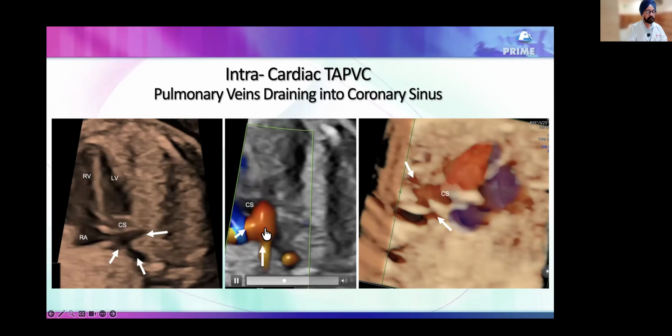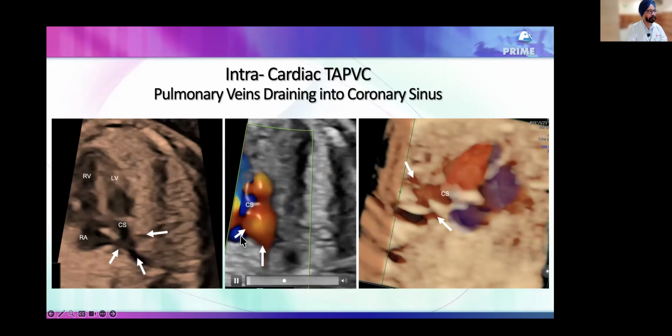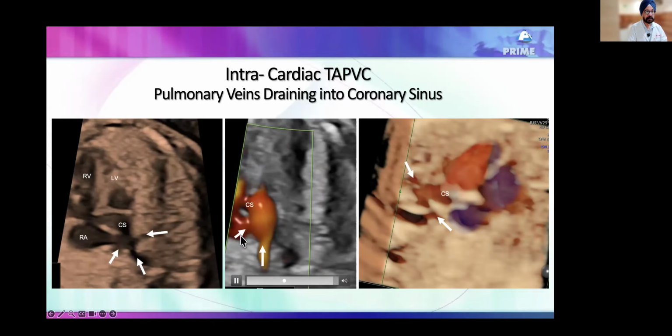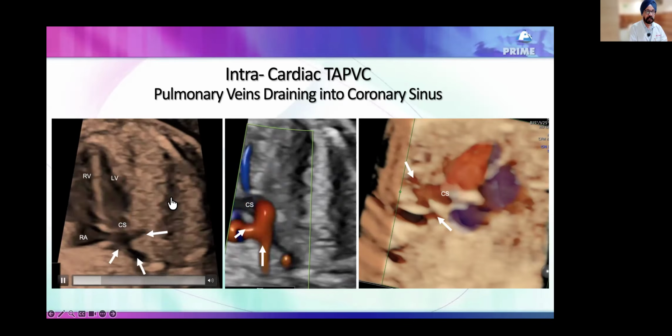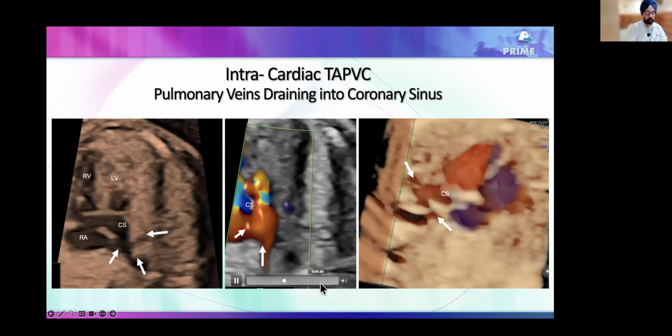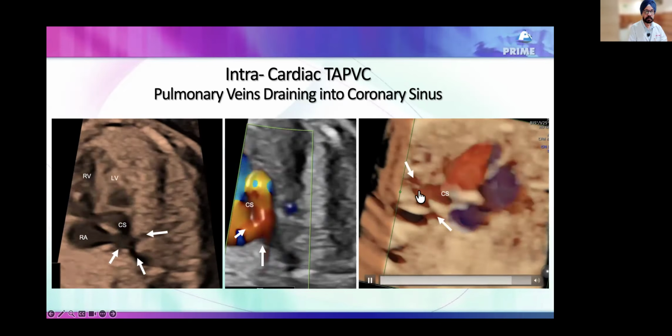Normally, one pulmonary vein, and you see this structure. Here you could not make out, it's going to the coronary sinus, right? And this was better. There was a 2D along with this. I cropped it, and then we did a three-dimensional fancy show.